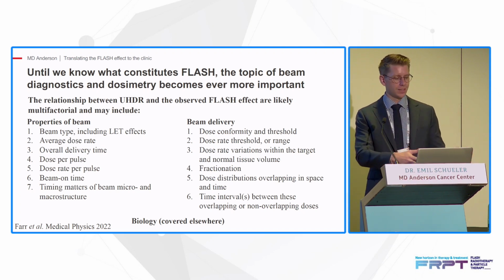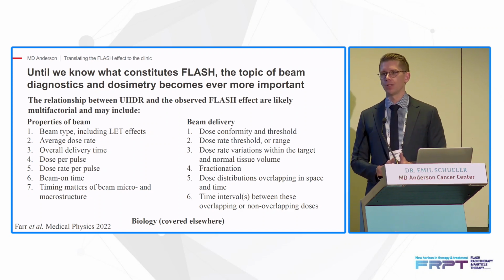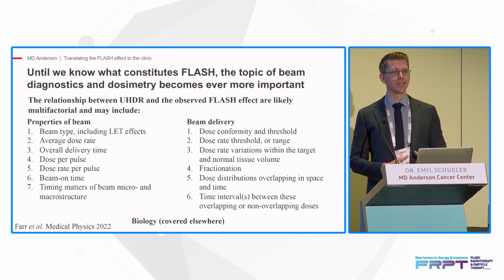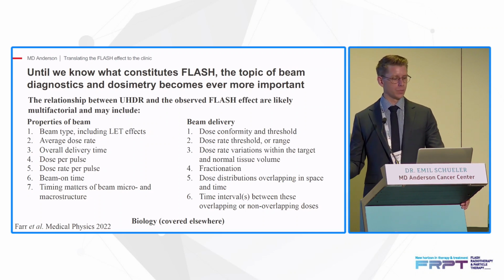This was a list that Farr et al. published earlier this year, and I'm just taking out the physics components of that, because the biology is obviously another big one, but I was only given a brief talk here today. It comes down to the properties of the beam themselves, and then also how to deliver it. That comes into the treatment planning.